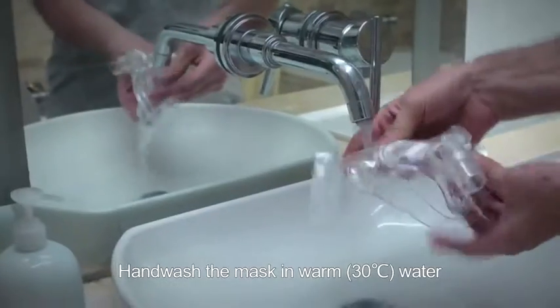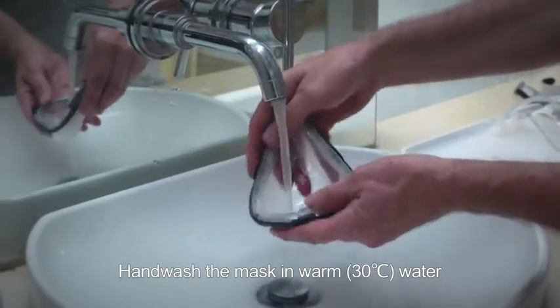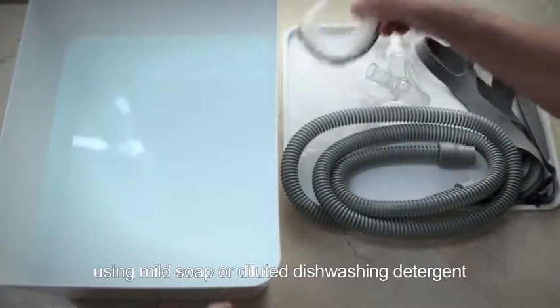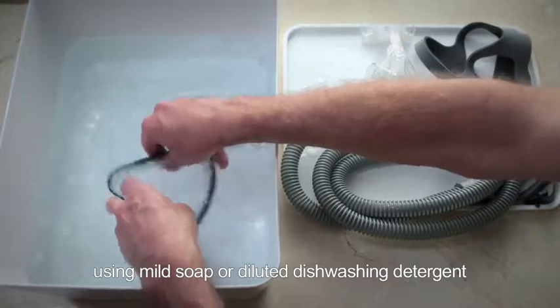Hand wash the mask in warm water at 30 degrees centigrade, using mild soap or diluted dishwashing detergent.